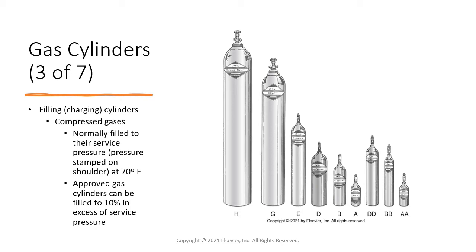How a cylinder is filled depends on whether its contents will be gaseous or liquid. Some gases stored in liquid form can remain at room temperature, but others have to be maintained in a cryogenic or super low temperature state.